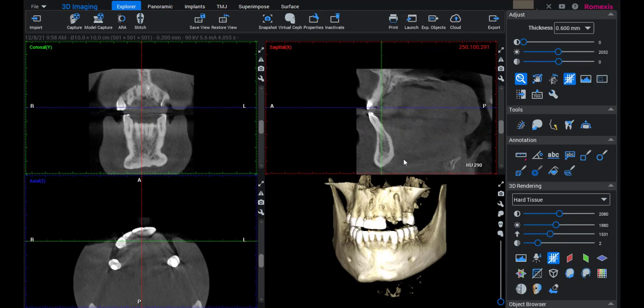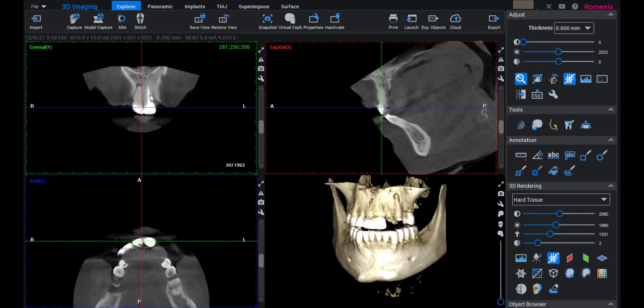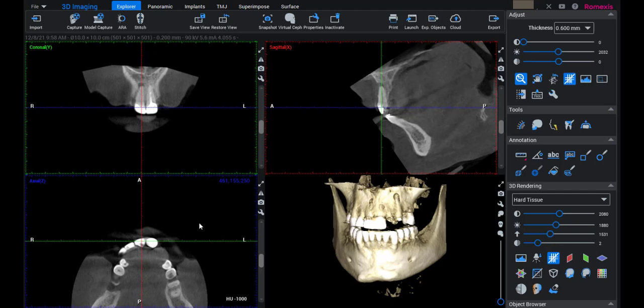Now in the sagittal view, I'm going to slide the arch over holding the left mouse button, then hold the right mouse button and rotate to get us almost centered on the tooth. In the coronal view, I'm going to left click and slide the view over.